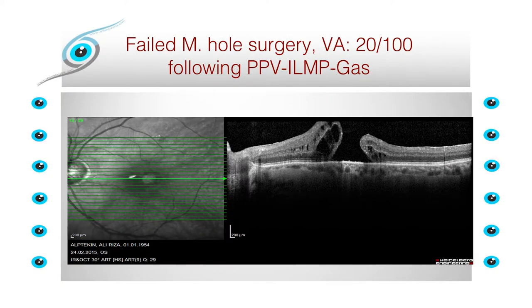And I tried another technique, hole aspiration under PFCL, massaging the edges of the macular hole and aspirating the fluid in between with a 39-gauge cannula. This is a technique suggested by Dr. Karabash from Turkey, my colleague. When you do that massaging under PFCL and aspirate the fluid in the hole, you see the closure of the hole even during the surgery. This usually helps in such cases, but as you see here, it didn't work for this case. After resorption of the gas, the hole was still there.